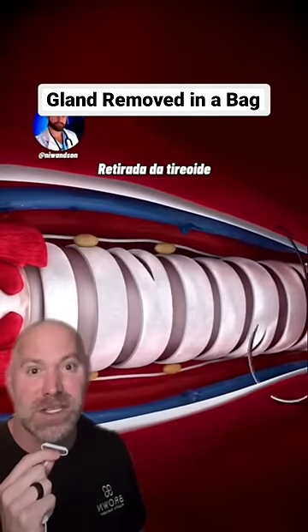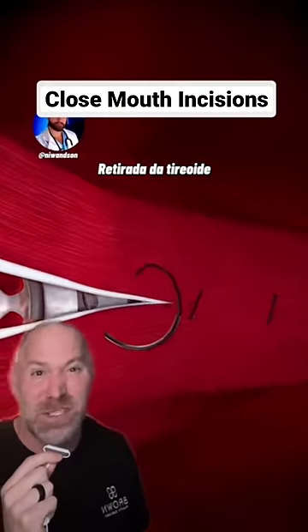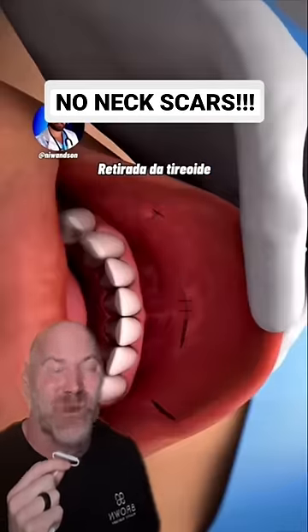The gland is removed in this little bag out through the mouth. They then close up the muscle. They make a few stitches in the mouth orally and there is no neck incision at all. That is crazy.